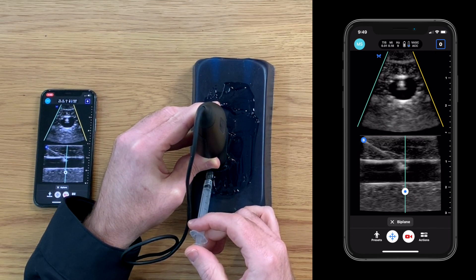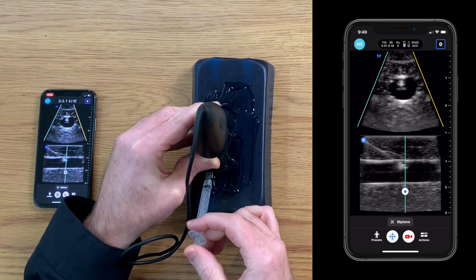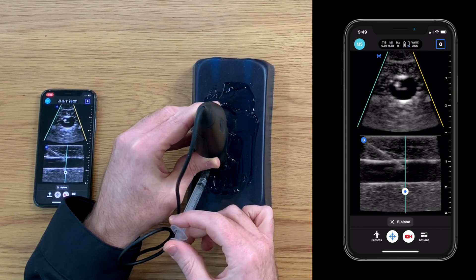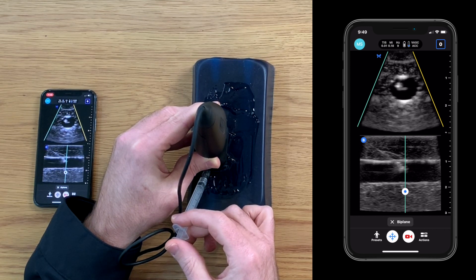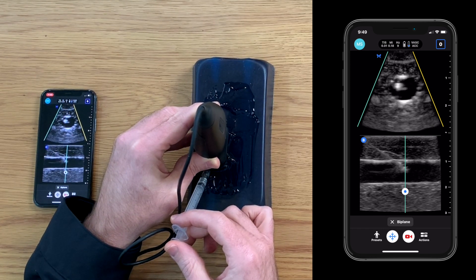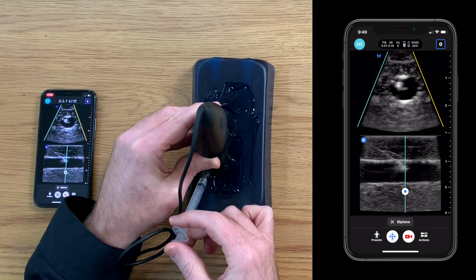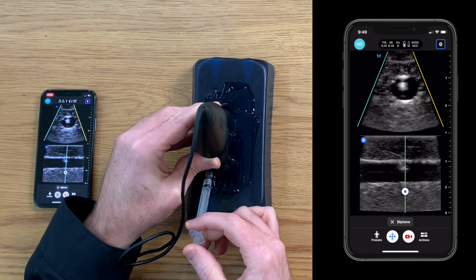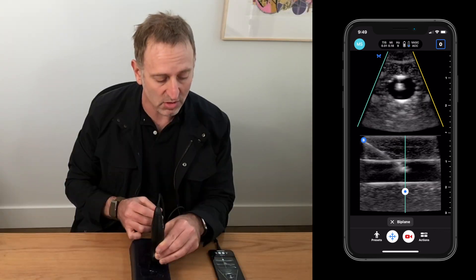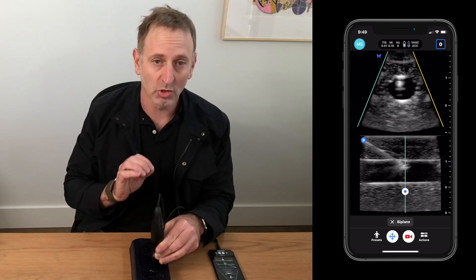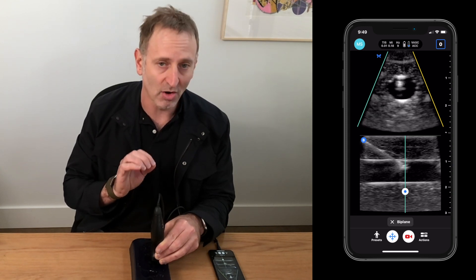Now if I had taken a less ideal approach and let's say I were off to the side — on the bottom image it still looks like I'm doing pretty well, but on the top image you can see that the needle tip is towards the left side of the screen with regards to the center of the vessel. I know that that side corresponds to the butterfly icon side on the IQ+, and I can simply move away from that to center it. This is what biplane affords us — a simultaneous two-plane image of a structure of interest that allows us to guide our needle with precision.